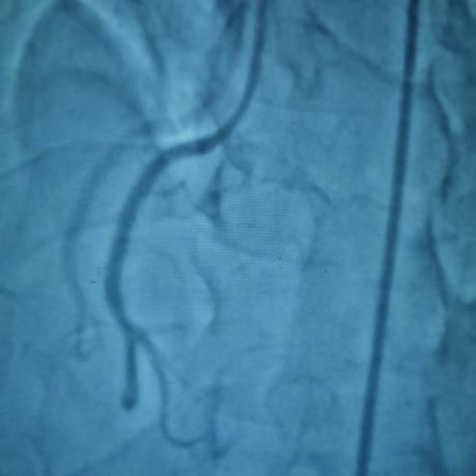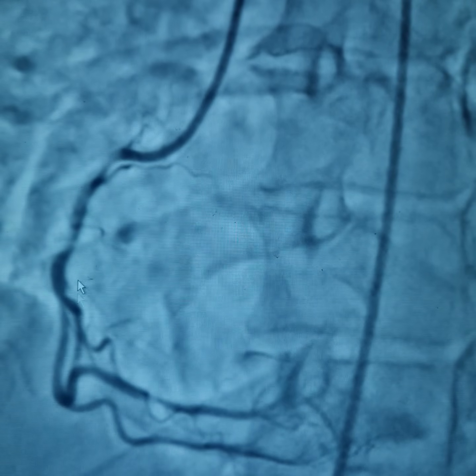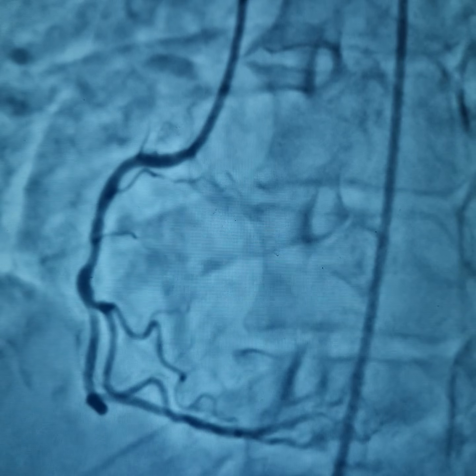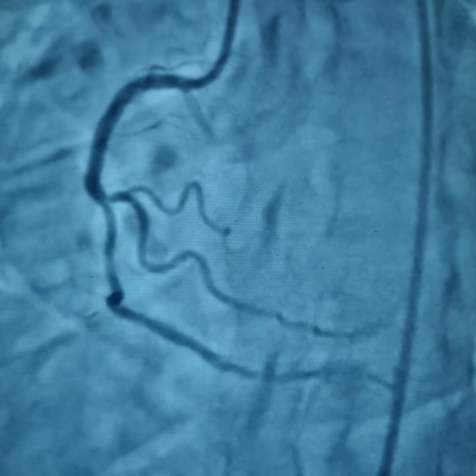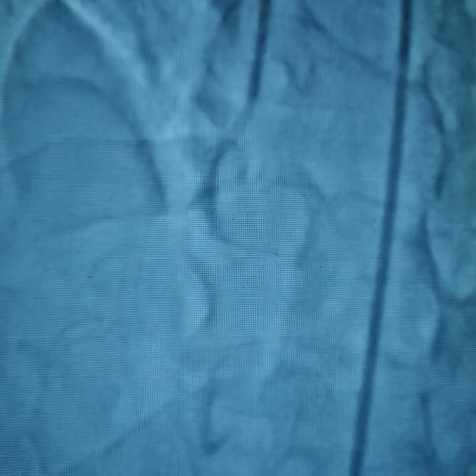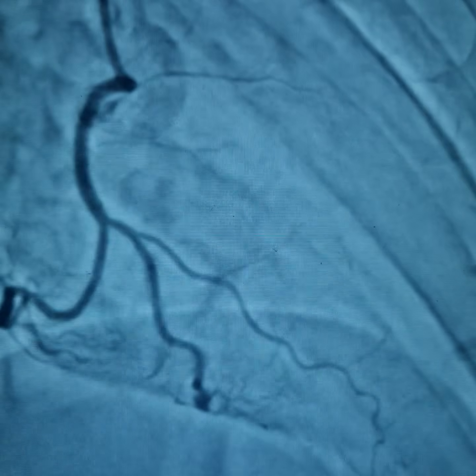Good results. And let me show you the first. The artery was very narrow, and you can see the distal artery here. This was the artery before, and I think the artery has opened up quite nicely. Yes, and the patient is all well and is being discharged. Thank you.